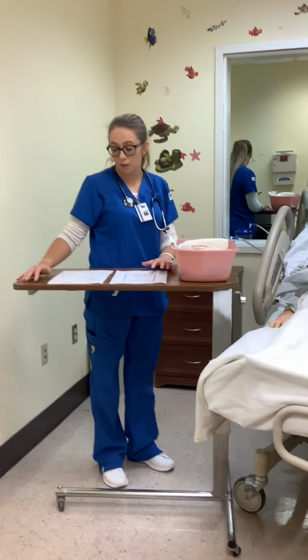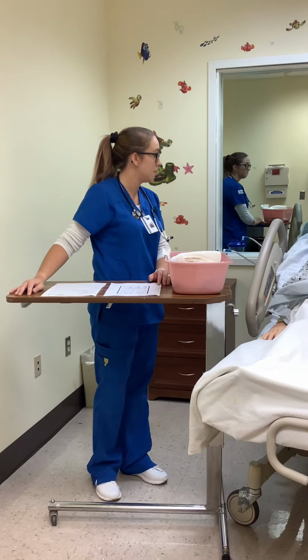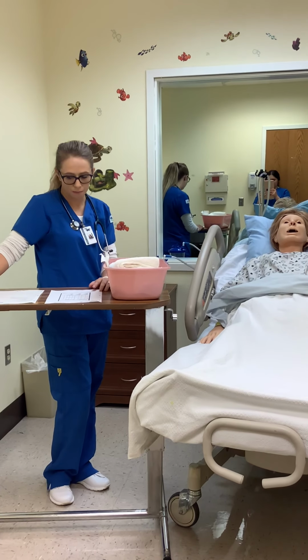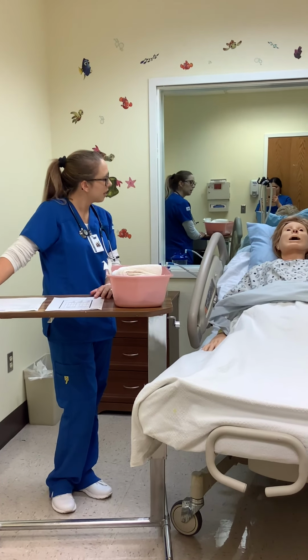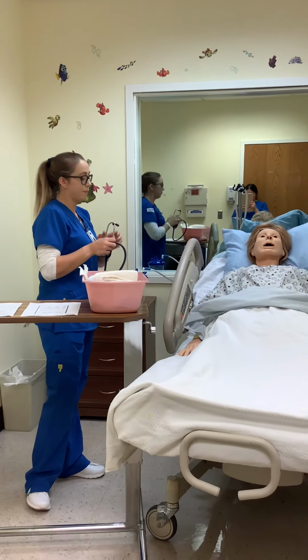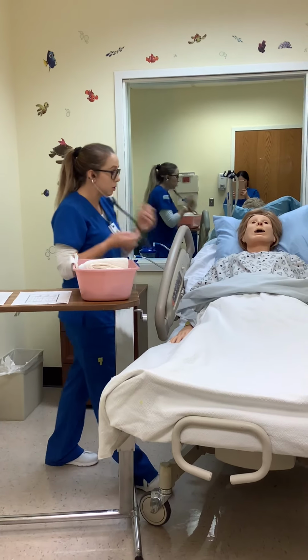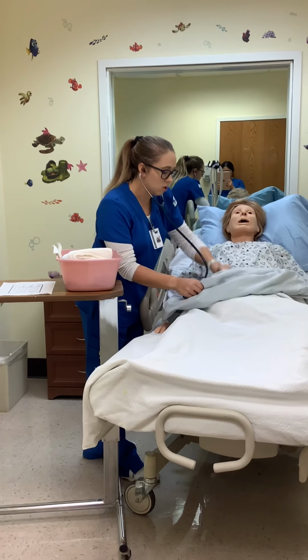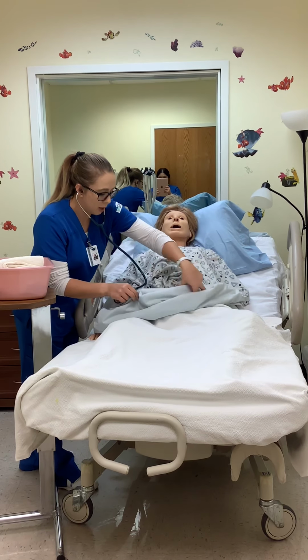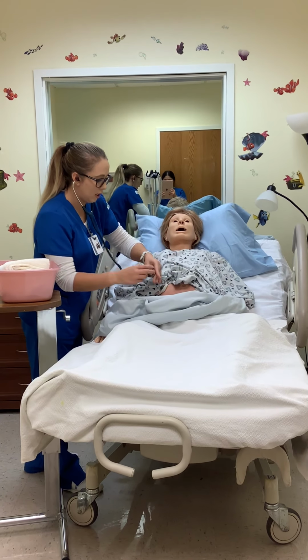Okay, Shirley, so you came in today having some pain. Can you scale that pain 0 to 10, 10 being the highest? A 7, oh, okay. Can you explain that pain for me? That's kind of like a dual pain? Okay, so first what I'm gonna do is I'm just gonna listen to your bowel sounds real quick. Making sure that we're pulling up, but also obtaining privacy.